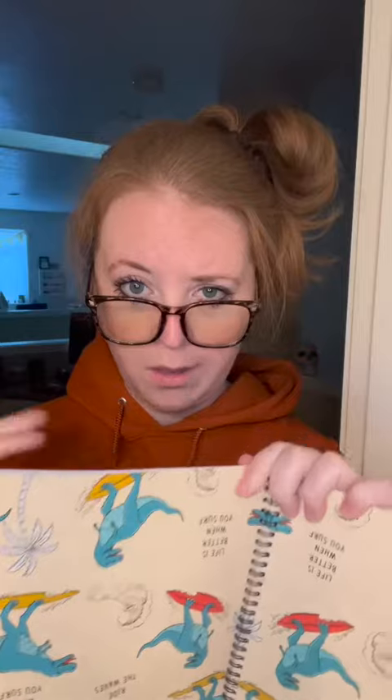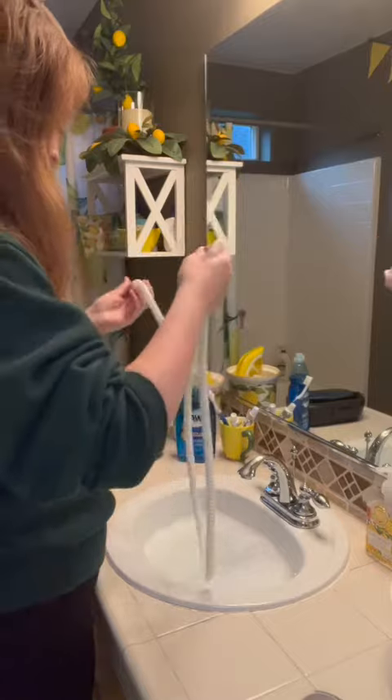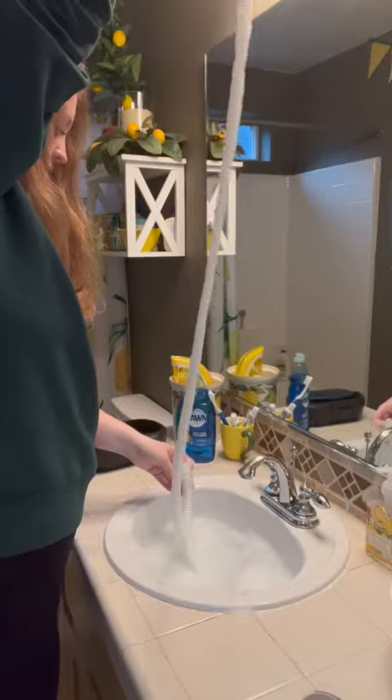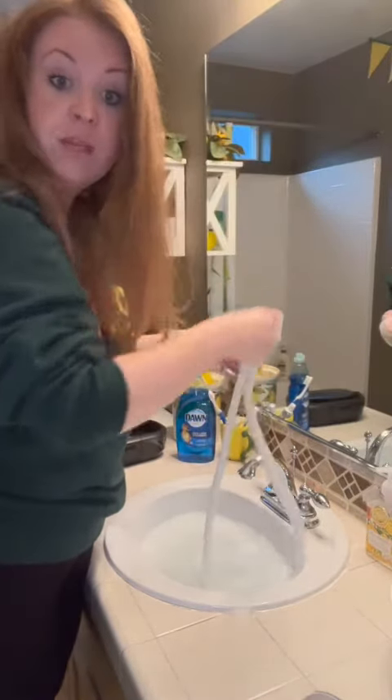Now you take your hose. This is the most chaotic clean you'll ever see in your life. Get some soapy water in the hose to, like, rinse it out. Yes, just like that. That's how you do that? Get all of that in there squeaky clean, if you know what I mean.